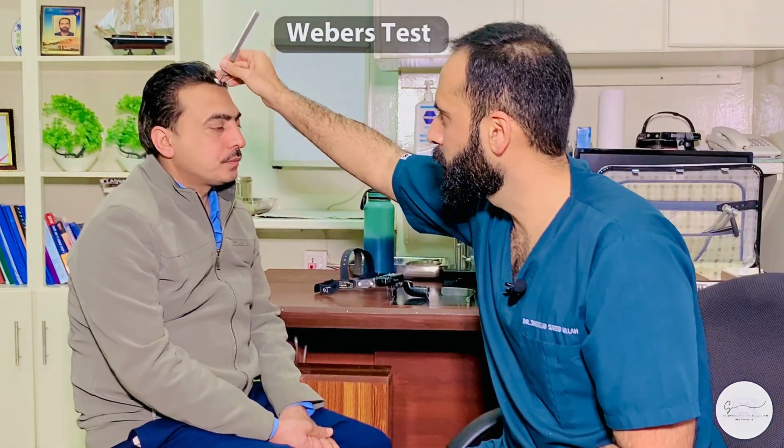So you can also place it on the upper incisors. The one that I usually use is the forehead. This is where I place the tuning fork.